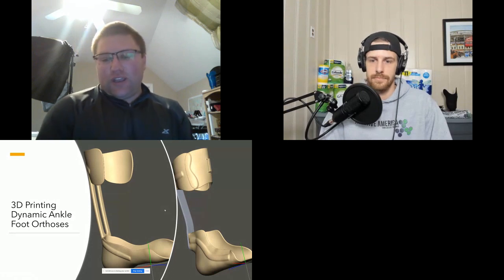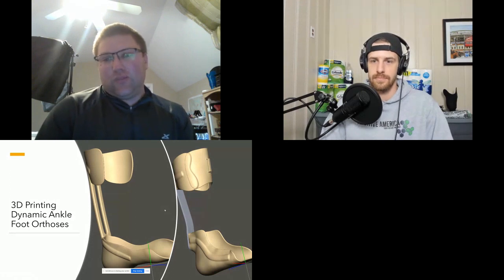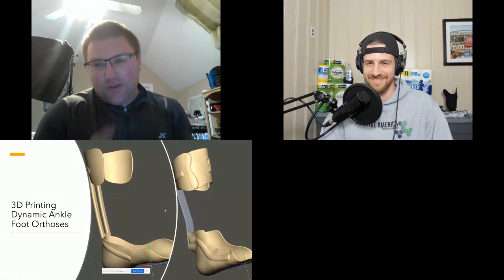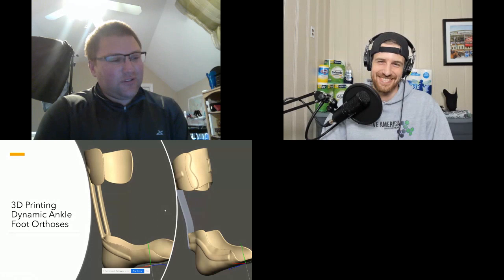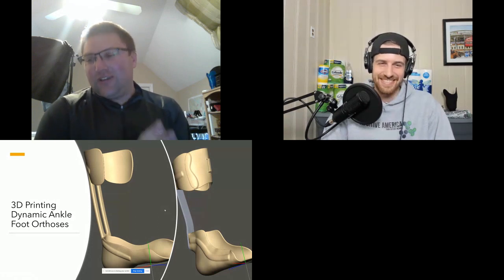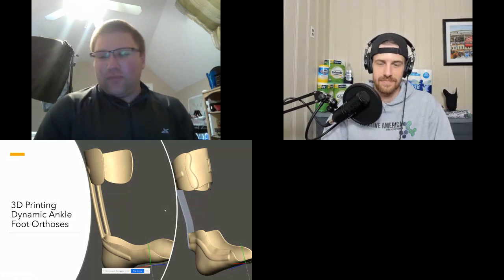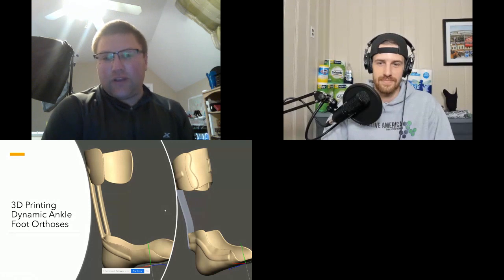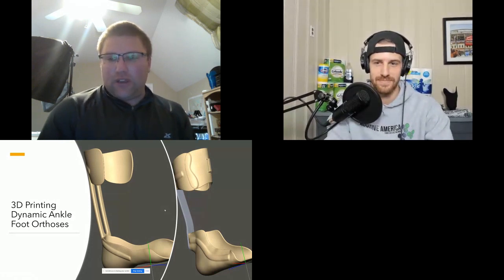Before we get too far into that, I wanted to share what an orthosis and a prosthesis are. If any of you have seen Forrest Gump, Captain Dan wears a prosthesis, or an artificial leg, and Forrest Gump wears a brace, or an orthosis. I'm going to show you a quick way of how we do thermal forming of a prosthesis. This is Frank from Sunstone Lab showing us how to do thermal forming. Here's a quick video of that.